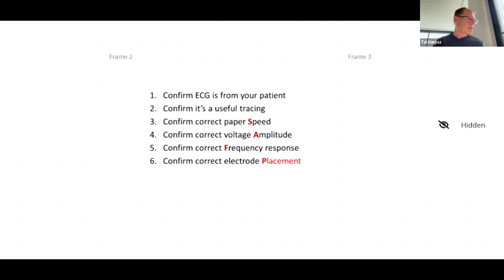Sorry, so as long as it fits into that band of 0.05 to 150, anything within that range is acceptable. And most hospital ones, as Anita says, go for 40 or 60, because once you start to go into that 150, I think it picks up too much interference and you have more of the artifact. That's right. It's just protection for us because we're in an uncontrolled environment. We can't predict where we're placing and using the equipment. So it's got to be protective for the uncontrolled environment.